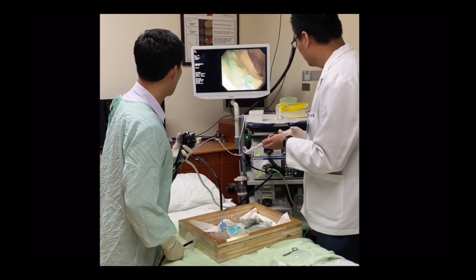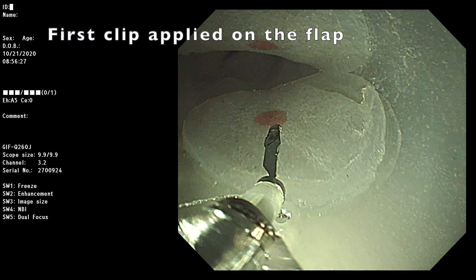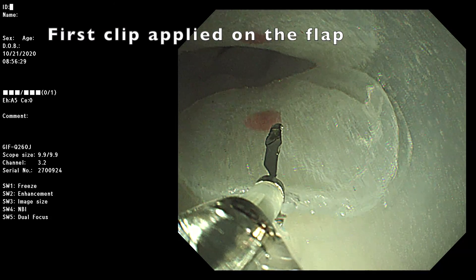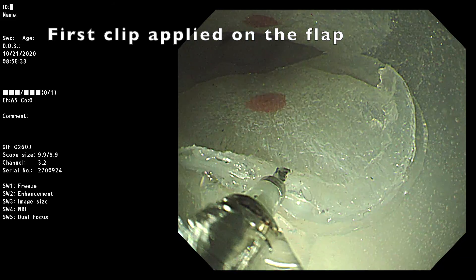The scope was then inserted into the model. The first clip was applied on the flap we previously made, and the traction force could be controlled using the thread.